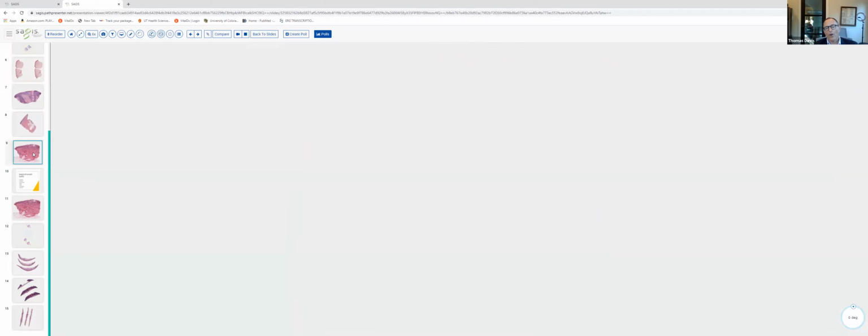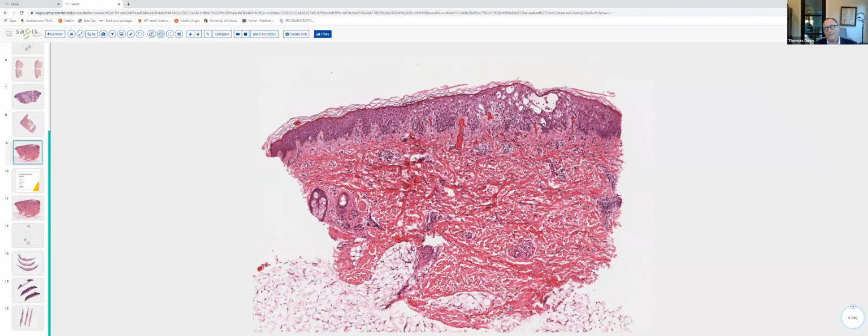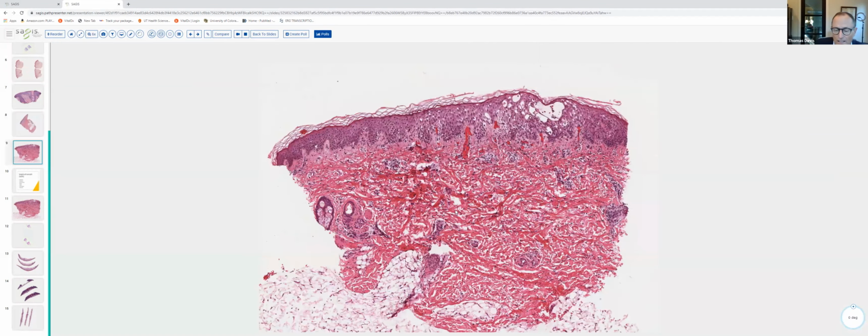Okay, we'll close out our discussion of spongiotic dermatitis with really what I consider to be more of a reaction pattern. And that will become more obvious as we discuss this case. Punch biopsy from the trunk. There is a basket weave cornified layer.